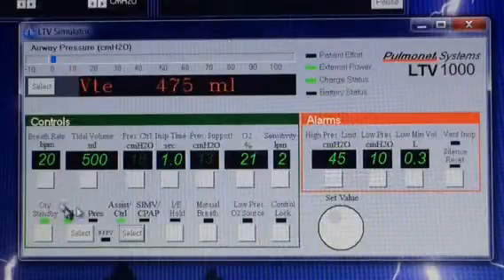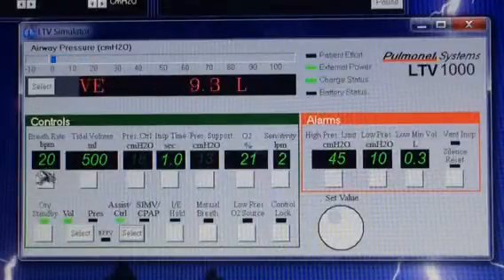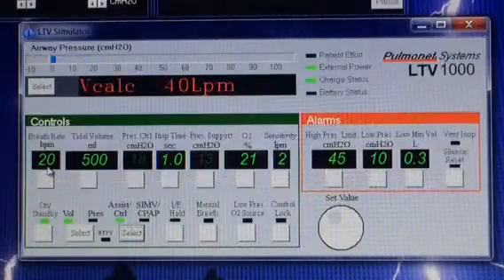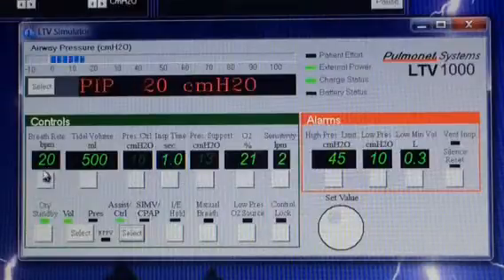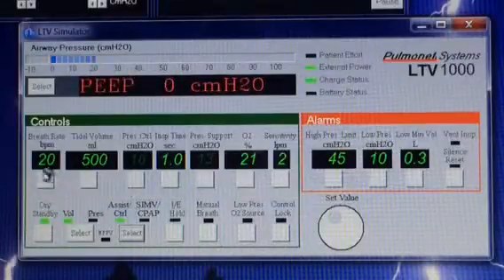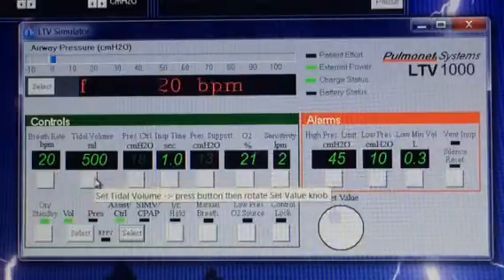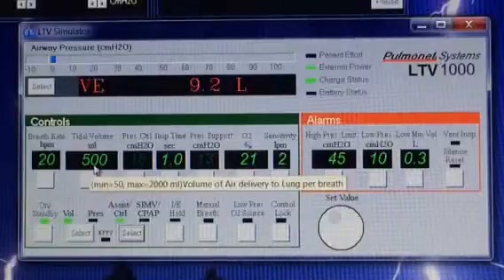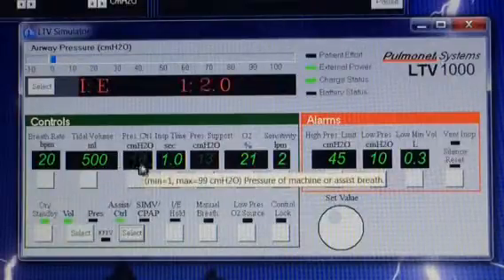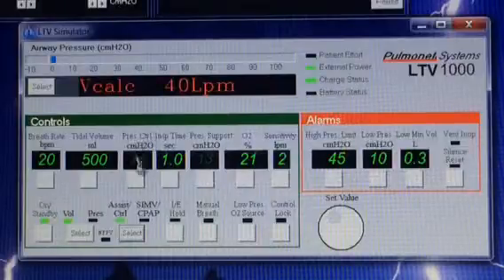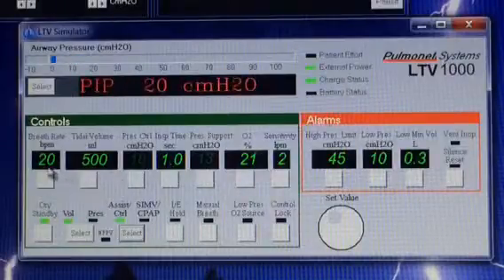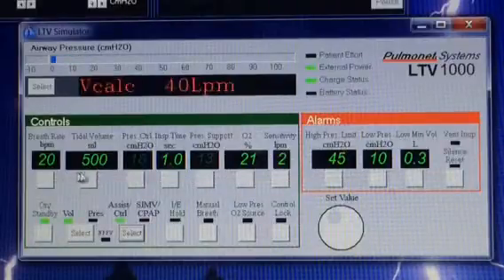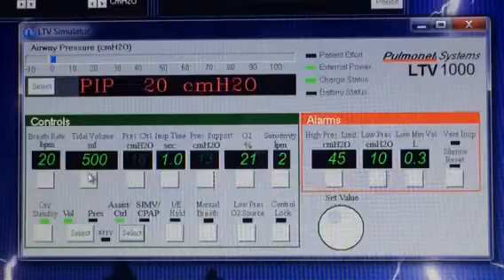To go through each setting: first, the breath rate. This ventilator, in this mode, will give 20 breaths a minute no matter what, or at least it's going to try to. The patient can initiate some extra breaths, but it will at least try to give 20 breaths per minute. The next setting is tidal volume. Notice that it's illuminated, so it is active, as opposed to the pressure control, which is dim and inactive — so we're going to ignore that and not chart it. It's going to give 20 breaths per minute, and each breath will be 500 milliliters.